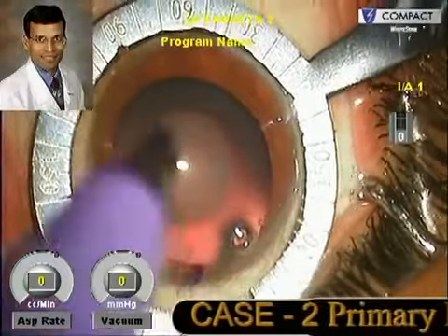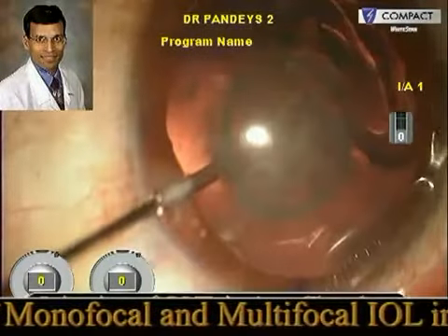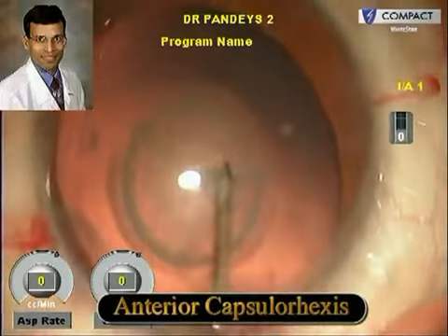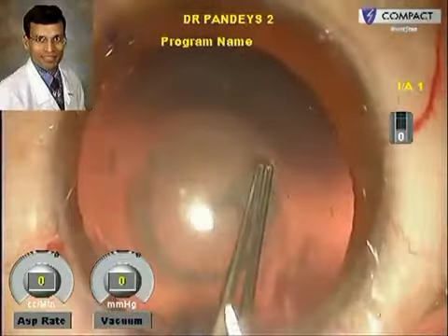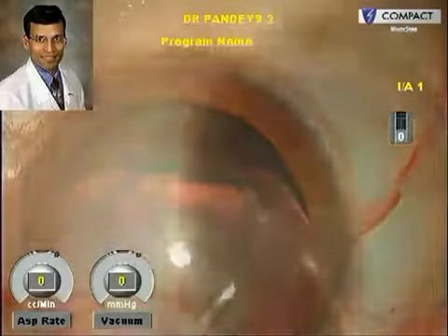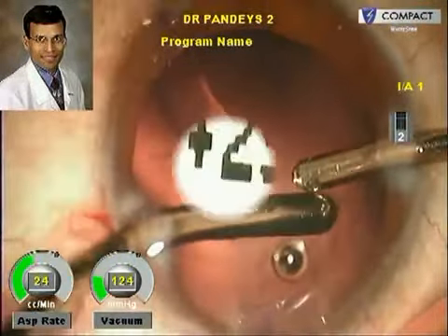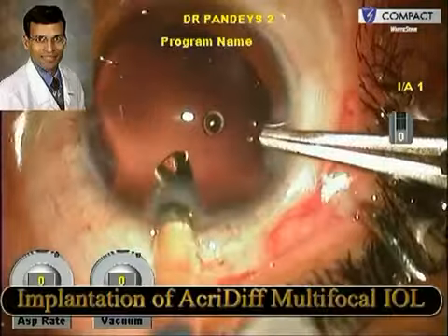This is the second case where primary piggyback IOL implantation was done for a developmental cataract using a combination of a monofocal and multifocal IOL. The standard surgical procedure includes the main incision at the steep axis, side ports, and a good anterior capsular rhexis — crucial not only because this is a developmental cataract but also for good IOL centration in refractive cases. The lens in this young patient was soft and easily aspirated using bimanual irrigation aspiration. An AcriDiff multifocal IOL of plus 29 diopters from Care Group India was implanted in the capsular bag.